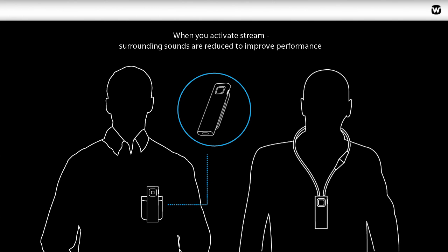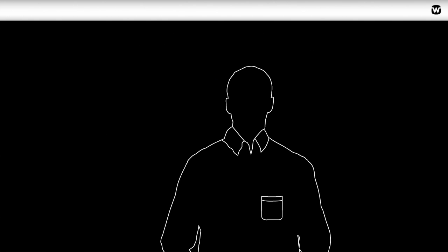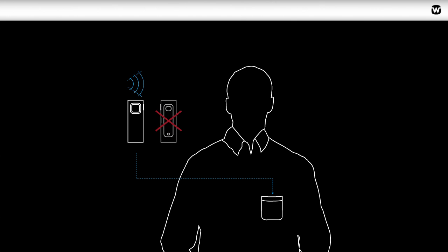When you place the Remote Mic on the person you are talking to, make sure it is placed on their shirt collar, front pocket, or any other part of their clothing where the clip can be attached. The device should always be placed outwards and with the clip on the inside.